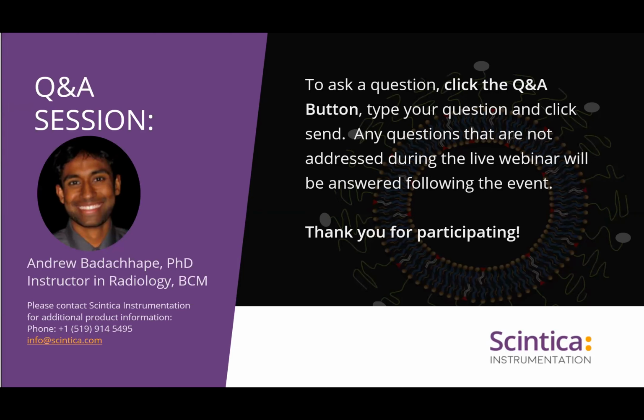But the size mostly has impacts on kinetics and clearance mechanisms, and that's really important for vascular imaging, Martin, the question you just asked. For conventional agents, you'll often have windows on the order of 10 or so minutes where you'll have the agent in the field of view, which is perfectly suitable for dynamic contrast imaging, where you're continuously injecting and taking real-time images. However, when you look at imaging the way that we're doing it, which we think is going to be more valuable for clinical use, administration and then post-contrast imaging, then having this long circulation is very critical.